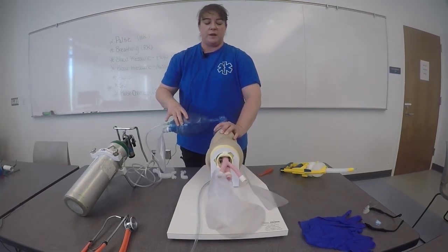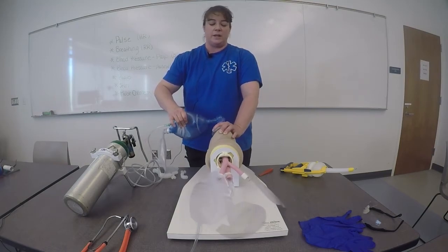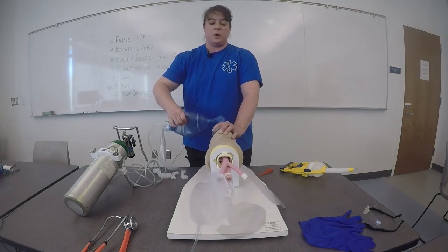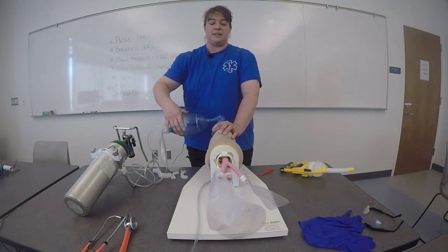I'll re-establish a mask-to-face seal and continue ventilations of one breath every five to six seconds. [Counting ventilation timing aloud: one breath every five to six seconds, continuing for approximately one minute with supplemental oxygen at 15 LPM via reservoir.] I can see chest rise and fall with each breath.